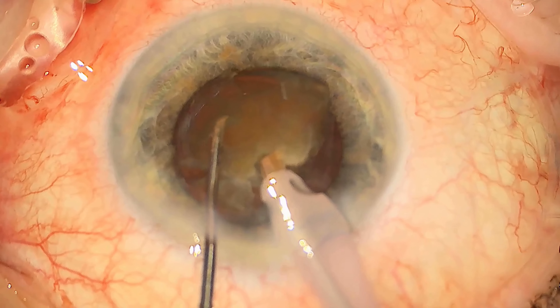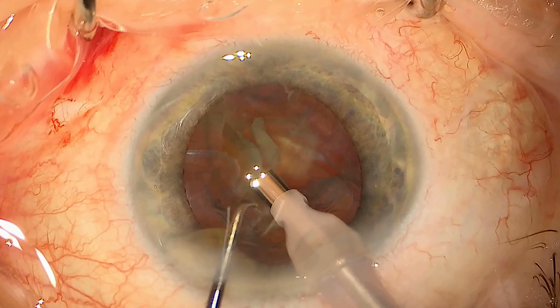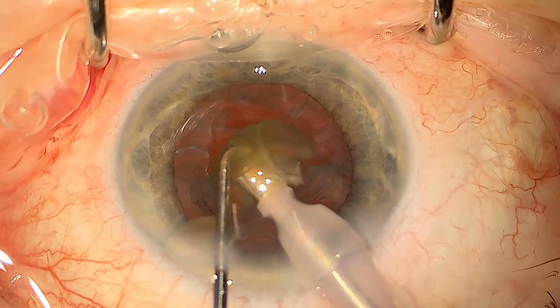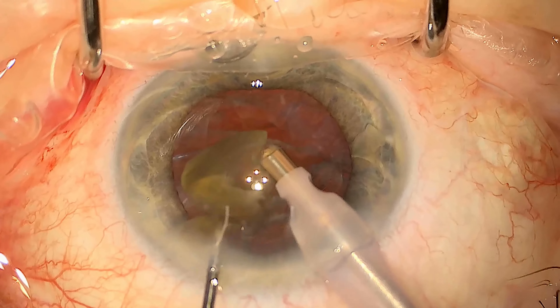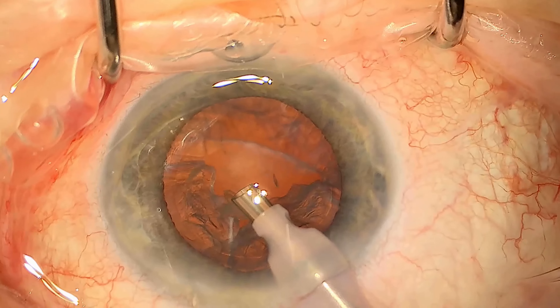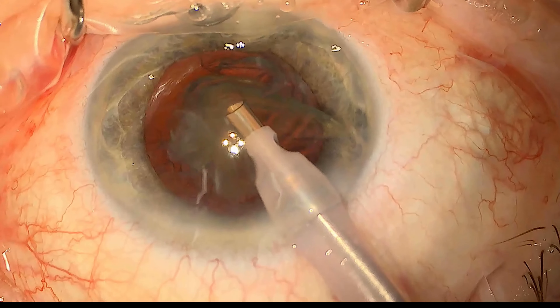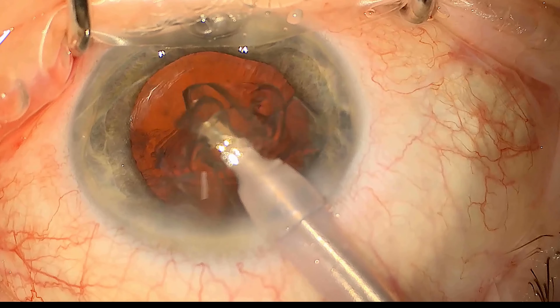And again chopping it further to remove the rest of the cataract until all we have is soft lens matter remaining. Now that the bulk of the hard cataract is away we can take away the softer part, or the epinucleus, which you can see coming away here.